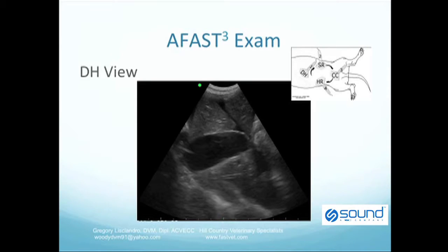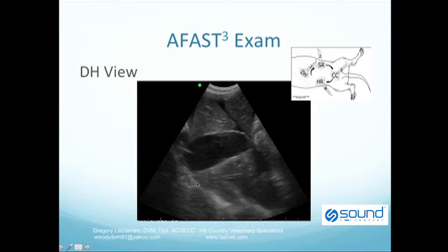On the DH view, what is classically obtained is the gallbladder kissing the diaphragm. You can see here as I draw the cursor around the gallbladder that it is kissing this other bright hyperechoic line, which is the diaphragm. We can also look into the pleural space with this type of depth.